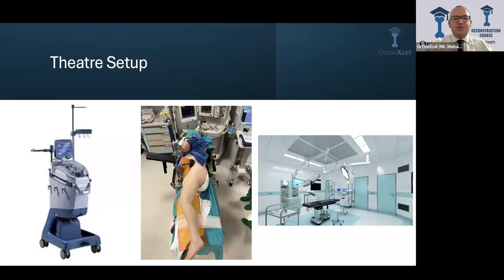So you need to square your pelvis. You need to be sure that your pelvis is square. If you prefer to work on an unsquare pelvis, you need to understand where the unsquareness of the pelvis is. Is your pelvis tilted anteriorly or tilted posteriorly? Because if it's tilted anteriorly, it will give you a false impression that this leg is long. If it's tilted posteriorly, it gives you a wrong impression that this limb is apparently short. And you can understand the inclination of the acetabulum only if you understand the position of the pelvis.